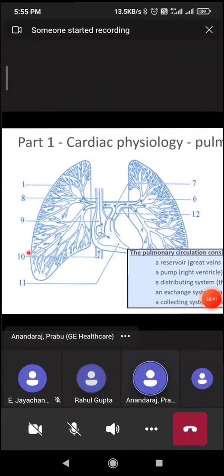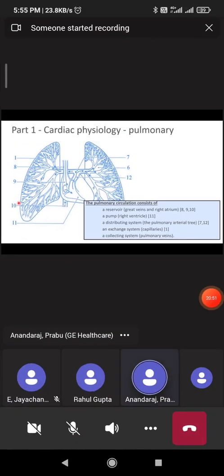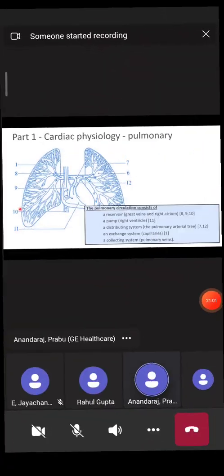What we are talking about here is just the physiological level of cardiac output, how much blood is coming. How we measure cardiac output, we have different methods. The gold standard is the thermodilution method, which people dealing with monitors will know. The one we have in R860 uses something called the Fick principle, and it's just based on the formula.